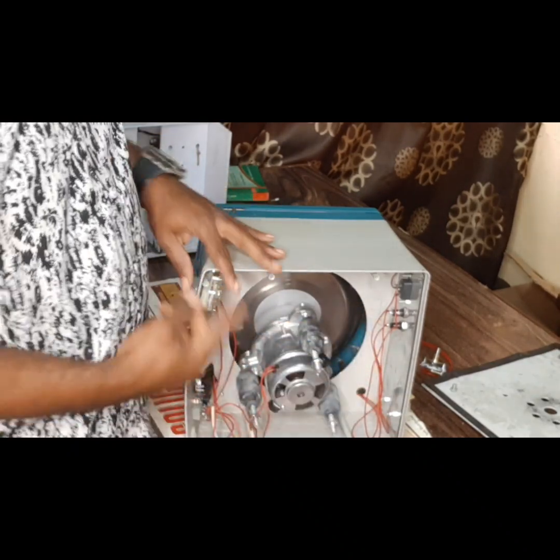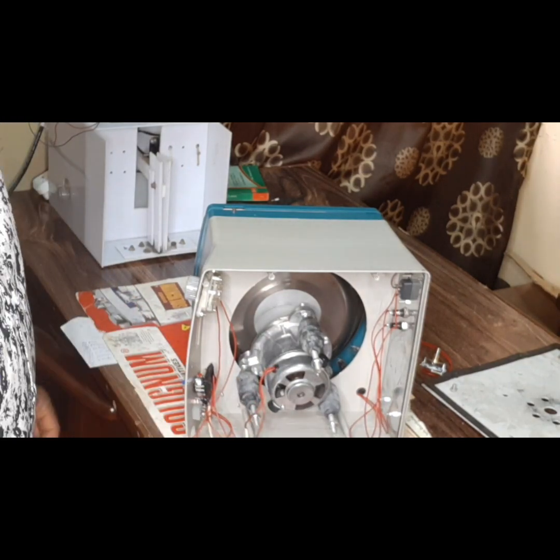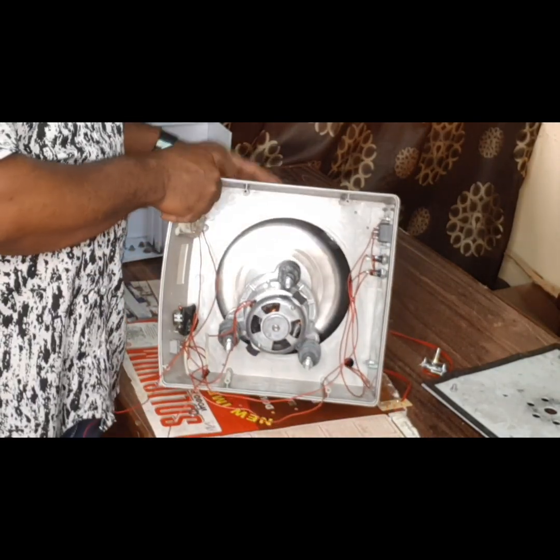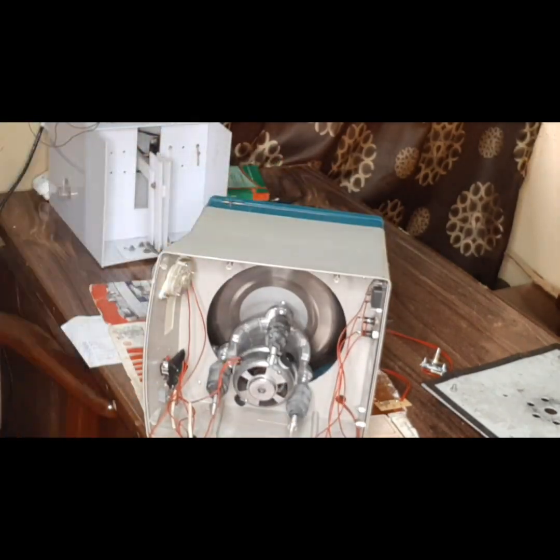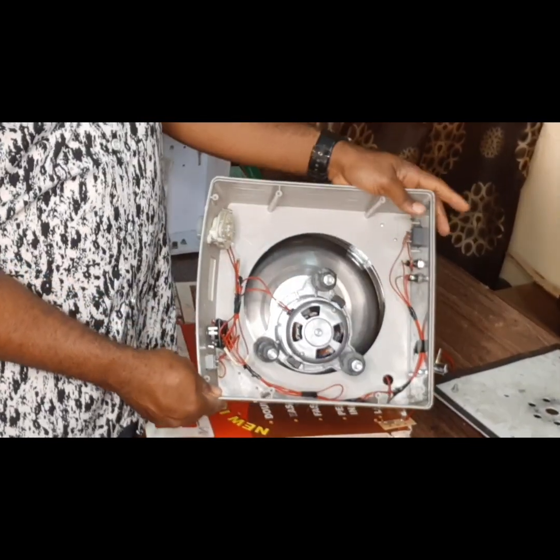I am going to tidy this cord to look nice, because as you can see they are scattered. So this is not the right thing to do. I won't want anything to cause breach. I don't know if you are seeing it very well. You can see how scattered. So I am going to tidy the cord. So we've been able to tidy the internal wiring.